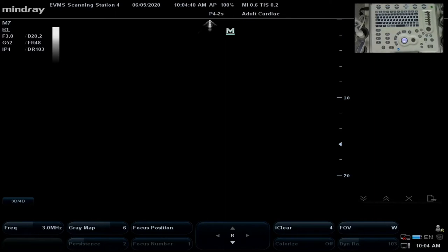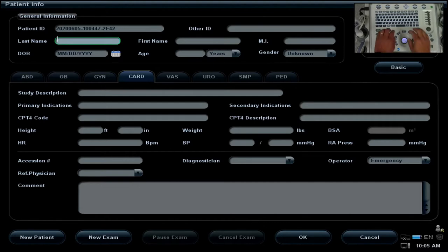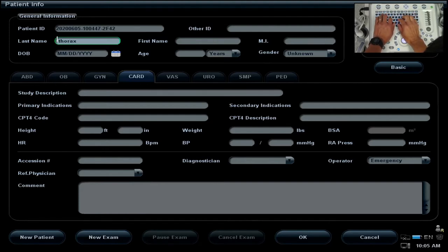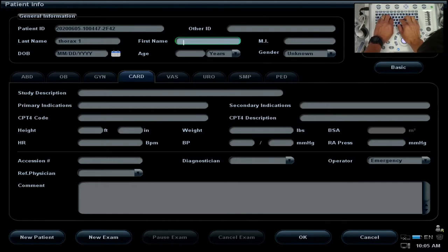We're looking at the screen of the MindRay 7 and going to use the patient information button seen here. That brings up a particular screen, and we're going to ask you to enter the patient information as instructed in Blackboard. It may vary depending on which course or program you're in. Typically this will show the module — for example, Thorax 1 — and in the first patient name field, you'll put your program and year, such as MPA 2024.